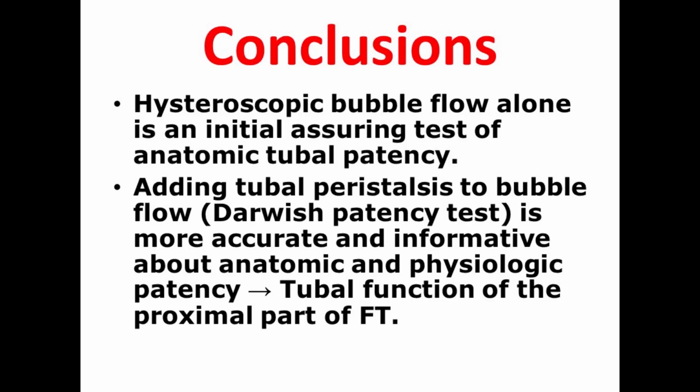In conclusion, I would say that the hysteroscopic bubble flow test alone is an initial assuring test of anatomic tubal patency, but adding tubal peristalsis to the bubble flow test, constructing what's called the hysteroscopic Darwishscope test, is more accurate and informative about anatomic as well as physiologic patency. This way, we can study tubal function of the proximal part via hysteroscopy.